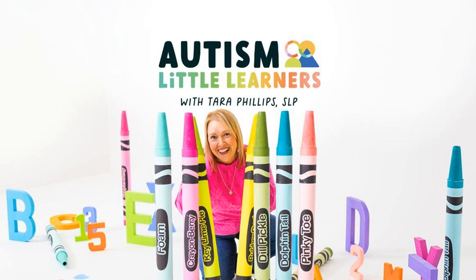First, we're going to talk about AAC devices, autism, and transitions. Transitions happen constantly in preschool and special education classes: arrival, circle time, lining up, cleaning up, going outside, and so on. Each transition offers a built-in opportunity for AAC modeling. Instead of rushing from one activity to the next, take a few extra seconds to slow down and model 1 or 2 key words on the AAC device.